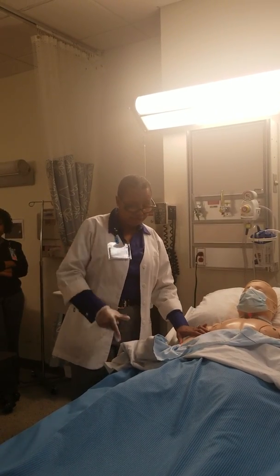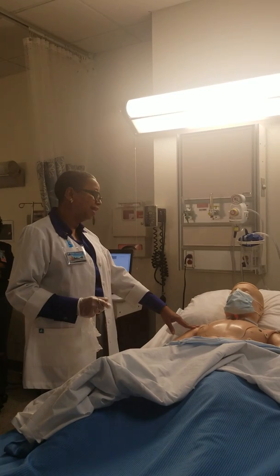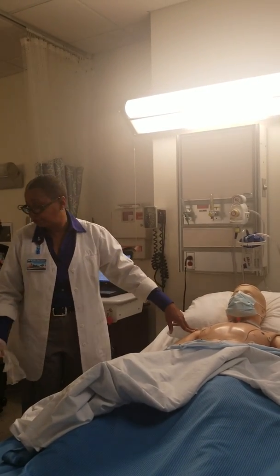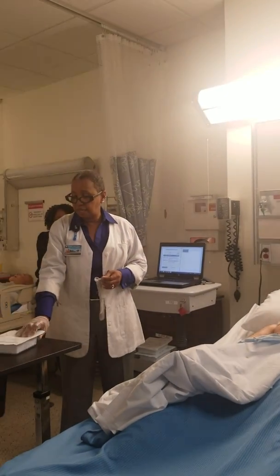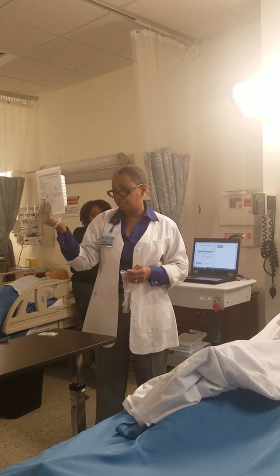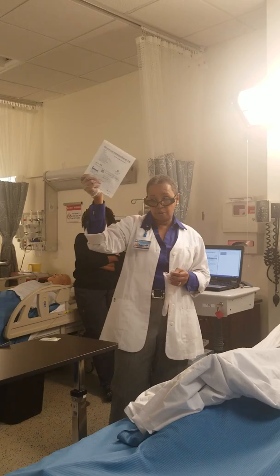I'm going to identify his name, date of birth, allergies. In particular, allergy to what? Chlorhexidine. Do you have an allergy to chlorhexidine? He's like, no. Thank you. So he's wonderful. Another beautiful patient. What about the iodine? You asked him about iodine too. Sometimes we don't, because these dressing change kits don't contain iodine. But if he has an allergy to ChloraPrep, you might have to change to something like iodine. That's when you change your protocol. Most of these have ChloraPrep in there.